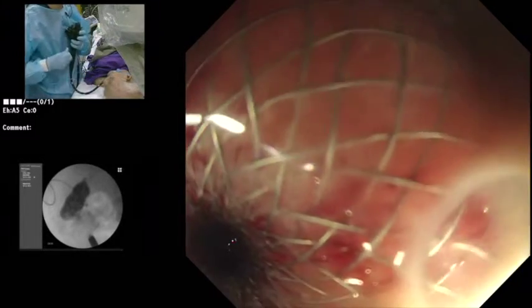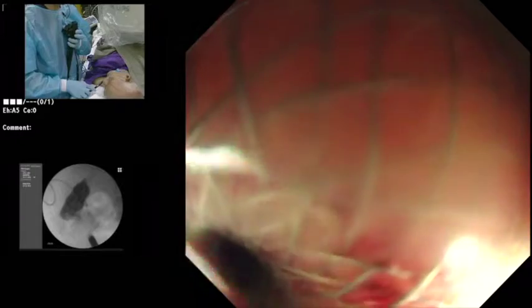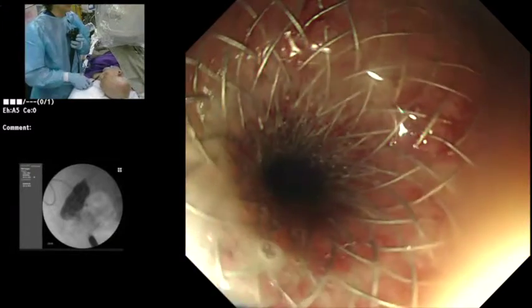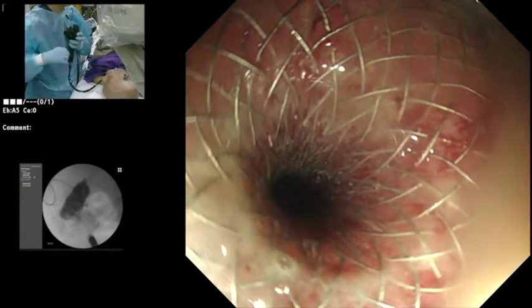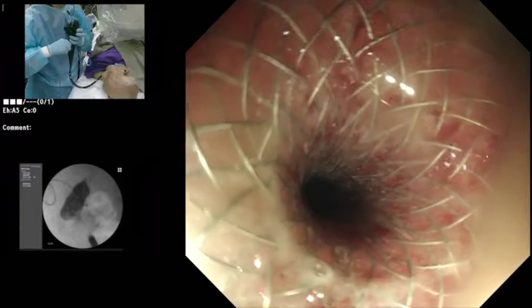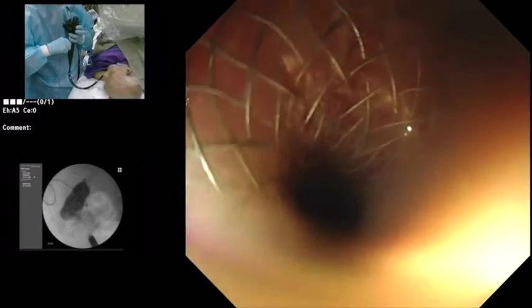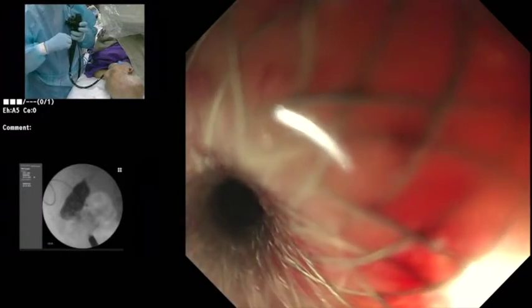So Ken, I saw that stent is very close to the pylorus. Yes, it seems that it's covered the passage to the second part of the duodenum. No, I realize that right now it may lend that impression, but afterwards the stent, especially after we dilate, it's going to shorten. It's going to shorten, and it will align itself very nicely and hug the wall of the duodenal bulb.